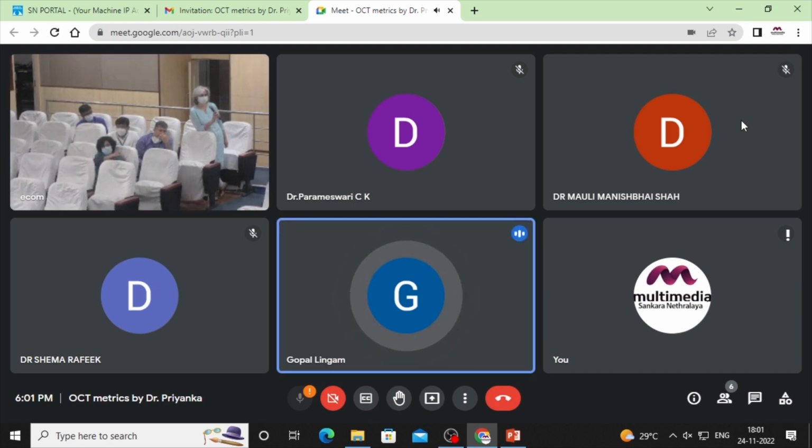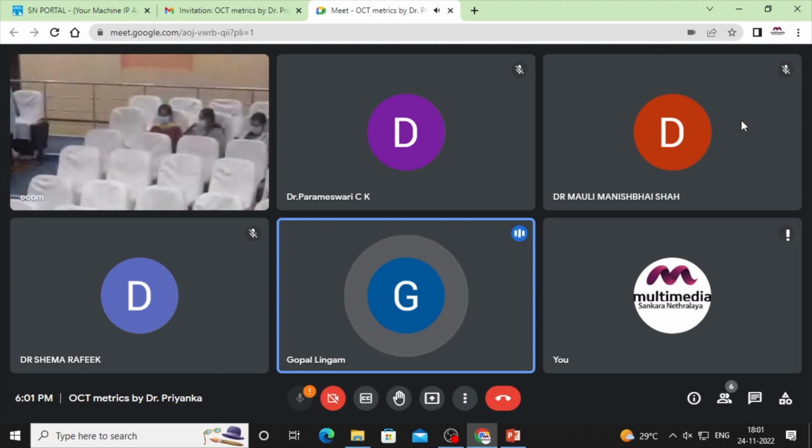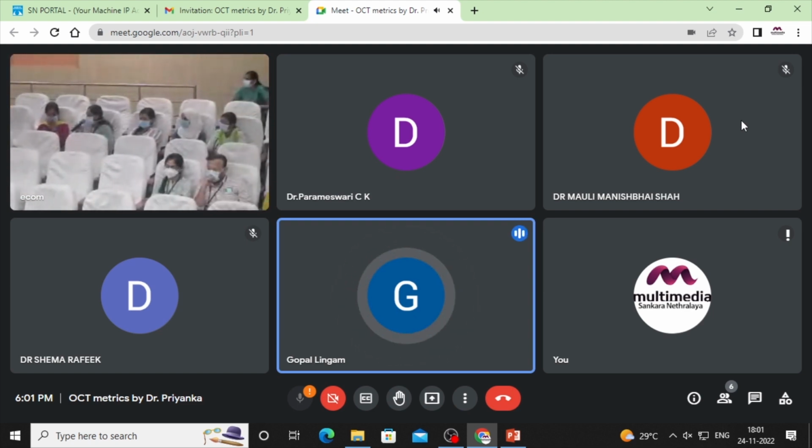Wherever you get a picture, at least some information is better than no information. This is for desperate cases where you cannot get a cube scan. You just capture individual single line scans, multiple scans. Wherever you can get a capture, you can capture. That information is still useful.